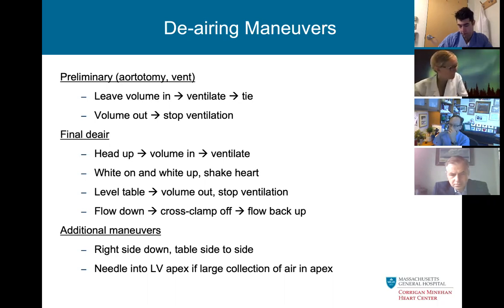I would just mention as an aside that using carbon dioxide in the field will reduce that, but the places you want to also look is in the dome of the left atrium, because there will sometimes be foam that's accumulated there, and you can very easily and safely aspirate that out with a 25 gauge needle. The echo anesthesia guys used to call out foam in the dome, but that's a very common place, particularly when the LA is enlarged.